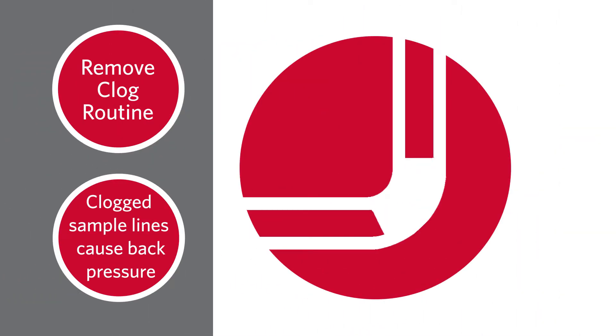Clogged sample lines cause back pressure, which in turn can cause the syringe valve to leak. If you need further information on how to run a remove clog routine, click here.